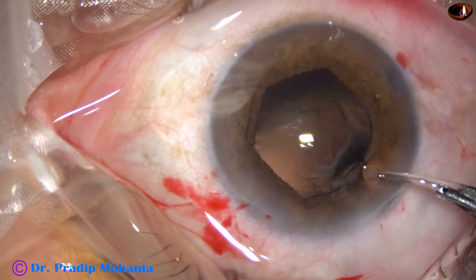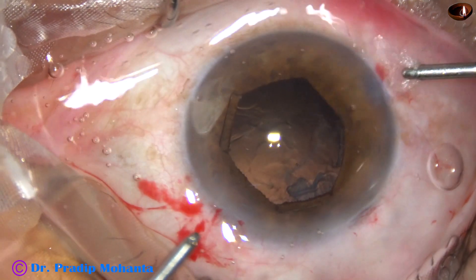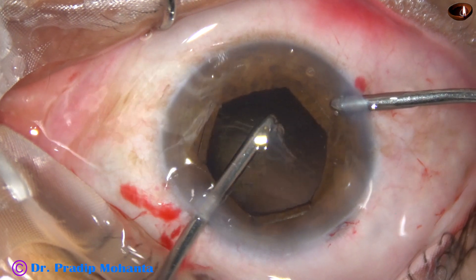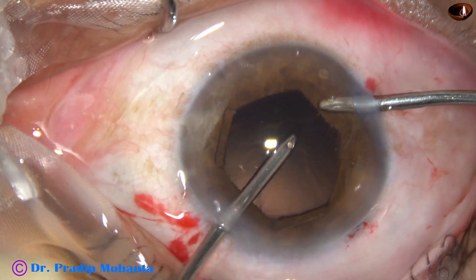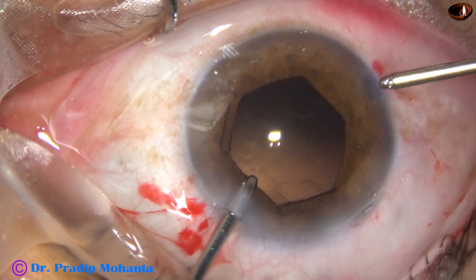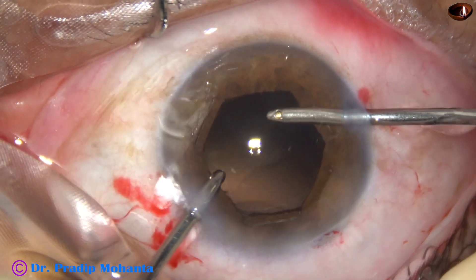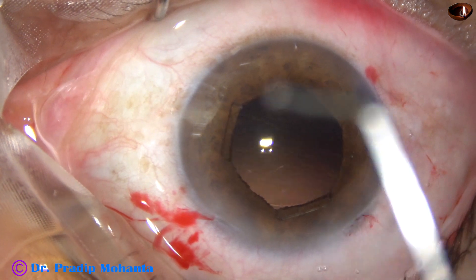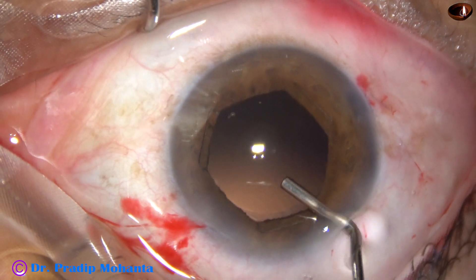I am removing some cortex from 5 o'clock. Then I am using bimanual irrigation aspiration for removal of cortex from 10 o'clock to 1 o'clock. There are some more lens fibers at 1 o'clock, and here it is — removed. Cortical cleanup has been done nicely. In this case there was very little cortex, as the epinucleus has been incorporated into the nucleus.